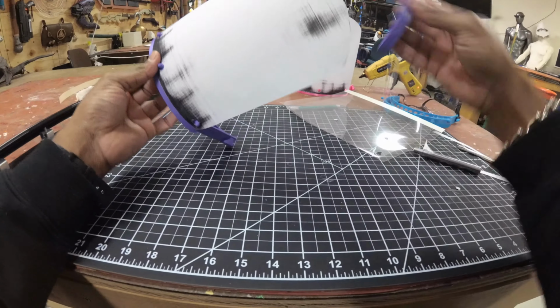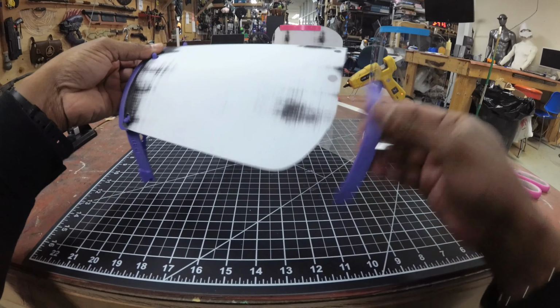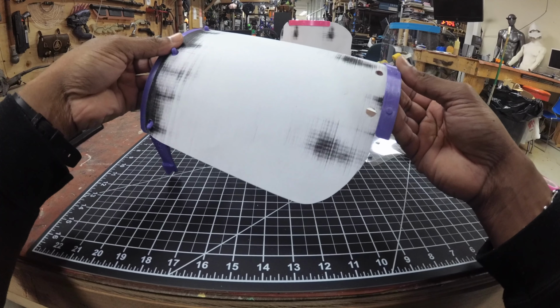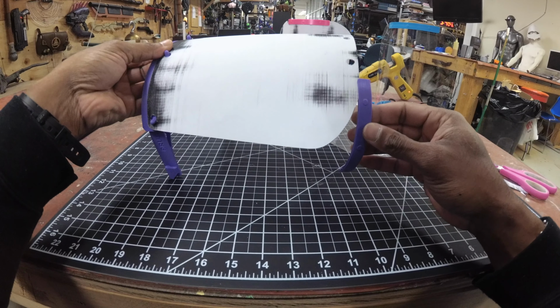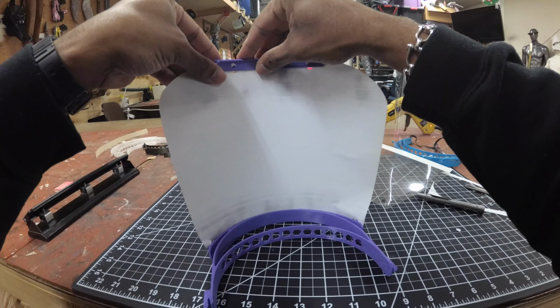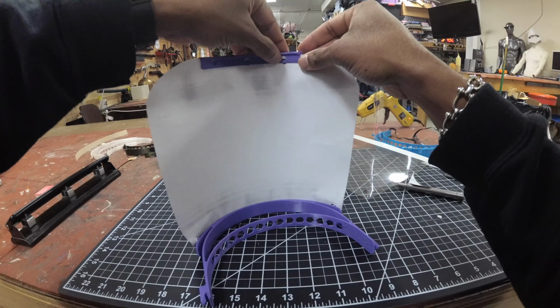Okay, that's nice. And then also test out this bottom piece here. Now with this, you can do it one of two ways. You can try to slide it in at the very top here. Sometimes that's a little hard to line up, so if that happens, you can just start from one end, slide it over, and then turn it over, and then just try to align the holes into the little tabs.